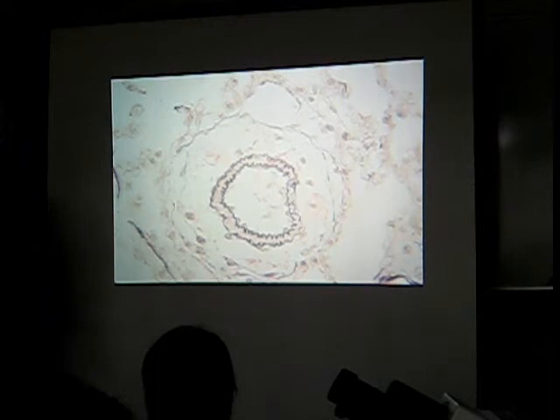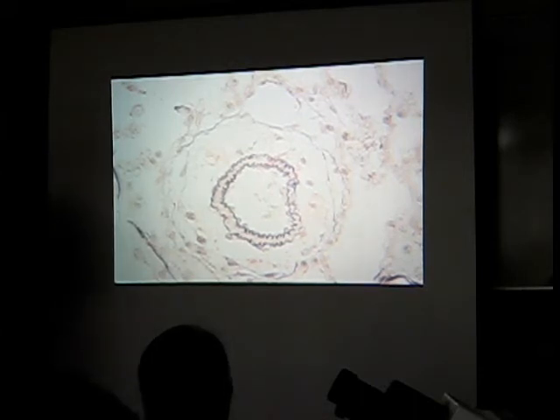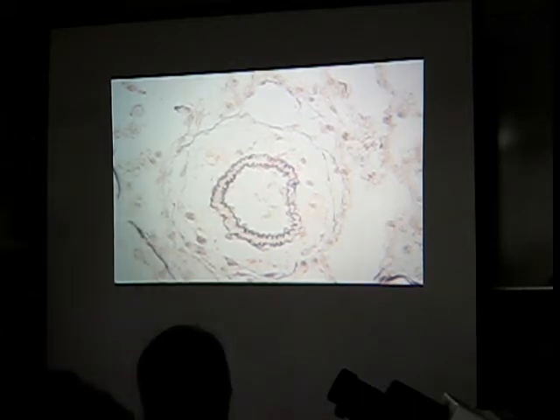Okay, so elastic stain tissue, we're talking about pulmonary circulation. Thin wall, so this has to be either a pulmonary artery or vein, right? Low pressure. Remember the right side of the heart, 20, 25 millimeters of mercury. Coming off the left side, you're talking 120 or more, all right? So thin wall, internal and external elastic lamina makes it the pulmonary artery. Yes.